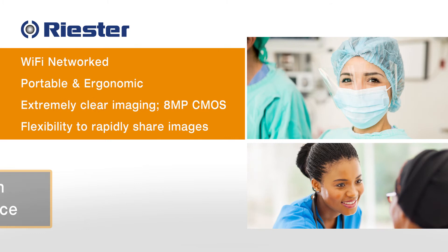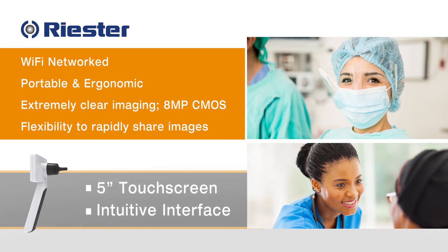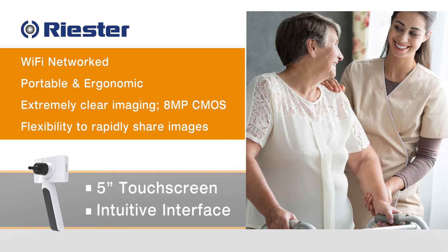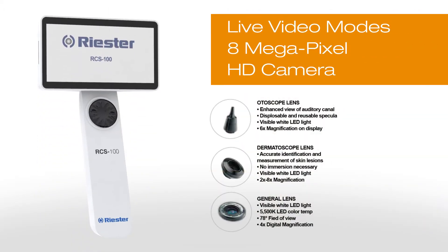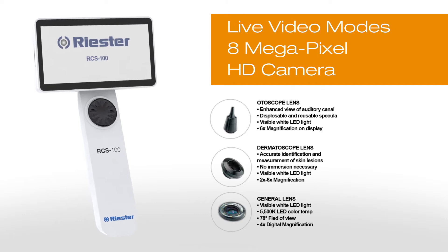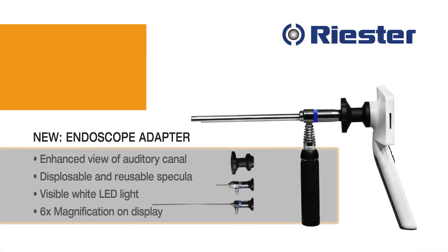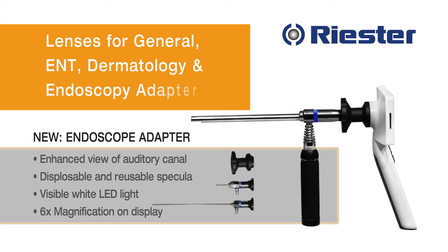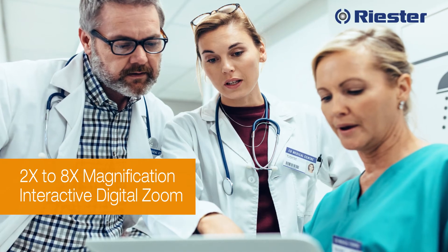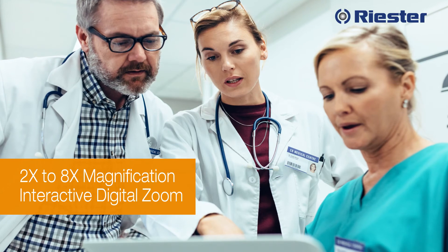The Riester RCS100 has provided improved healthcare to thousands of patients where access was not viable. Live video modes and an 8-megapixel high-definition camera are critical. Lenses designed for general practice, ENT, dermatology, and endoscopy adapters are applicable to many specialties. Its 2-8x magnification with interactive digital zoom provides excellent detail.